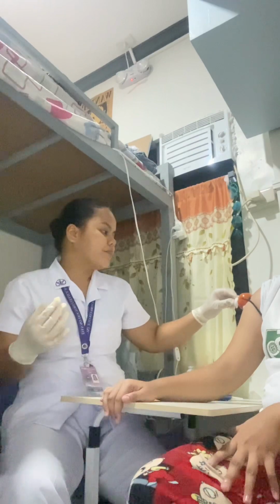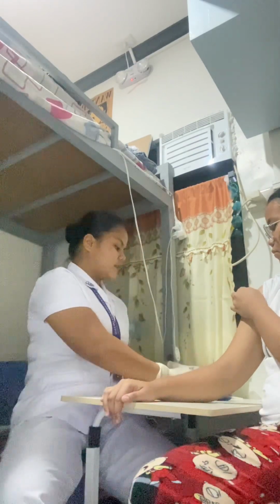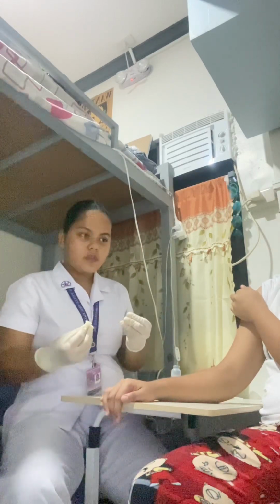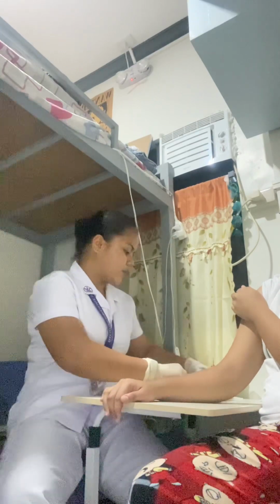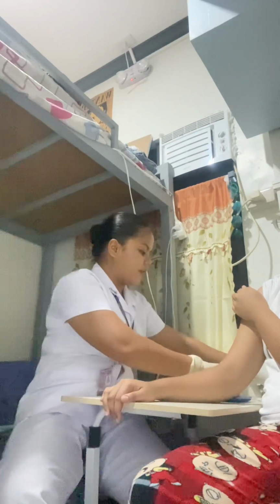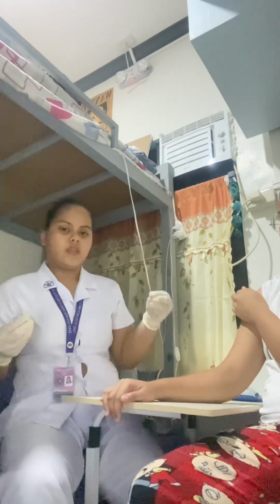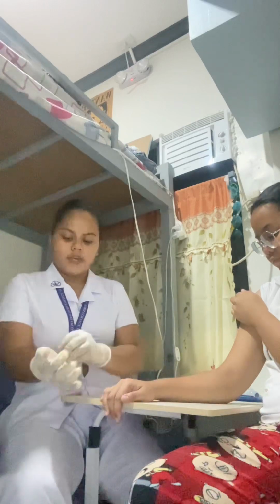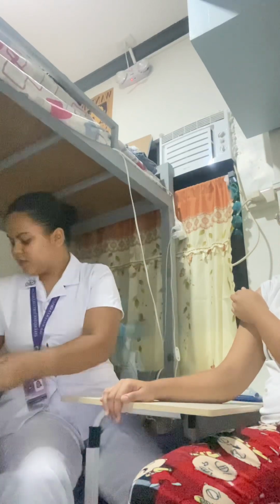Also, I'm going to activate. Can you hold this for me, ma'am? I'm going to activate a safety needle device to dispose of them properly. So I have here a sharp container, in which I'm going to dispose the needles I've used, and then I'll remove the gloves I used and perform hand hygiene.